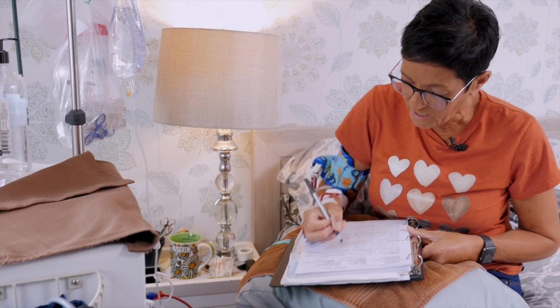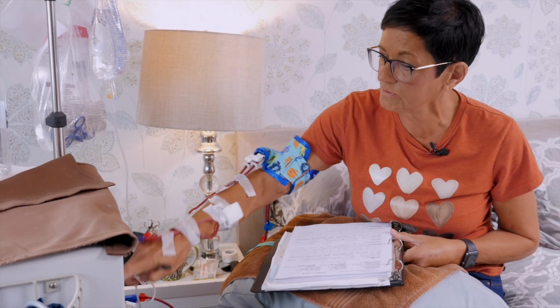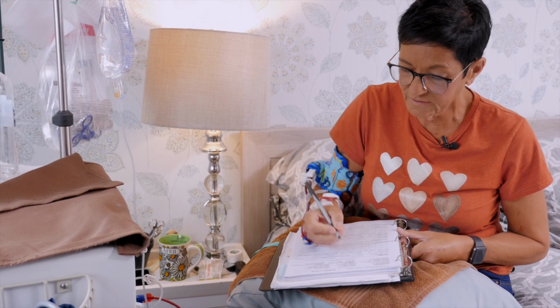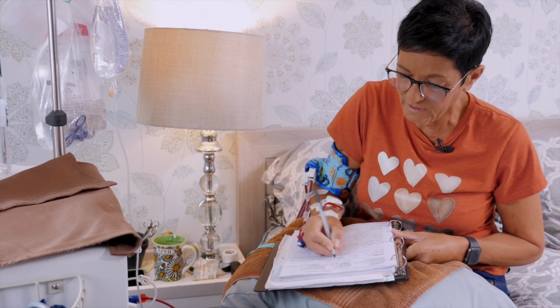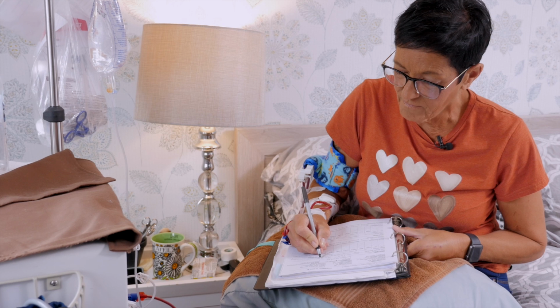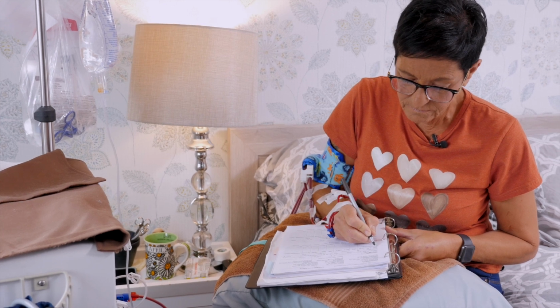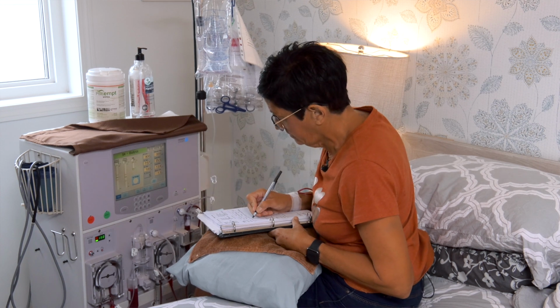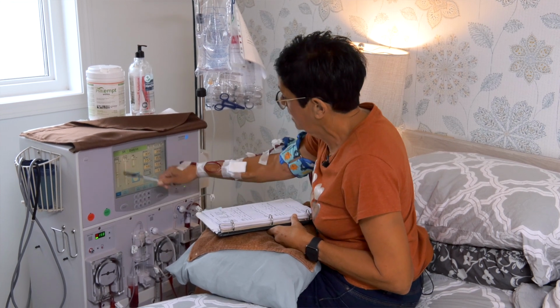So I just record my heparin, how much was in the initial bolus, and then just different things off the screen, my conductivity, my start time, my blood flow rate is 150, and then my pressure.